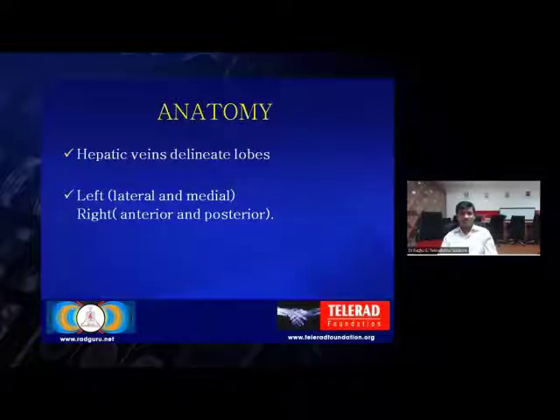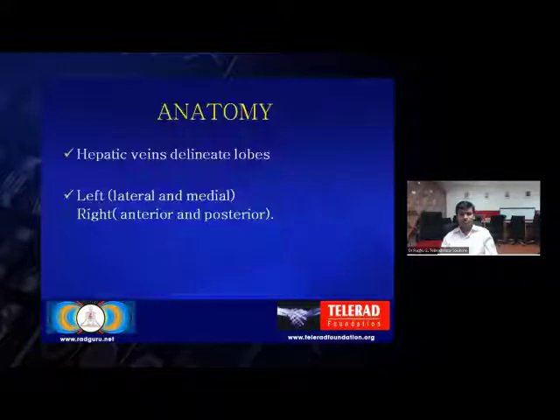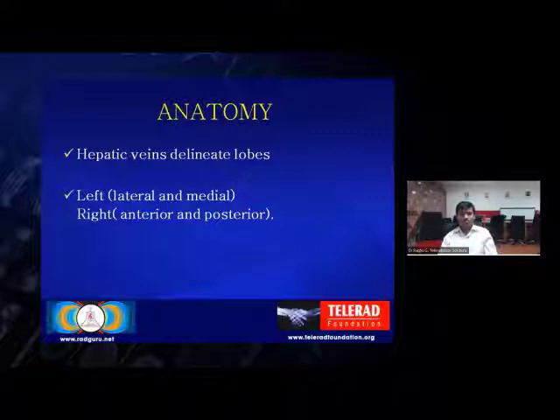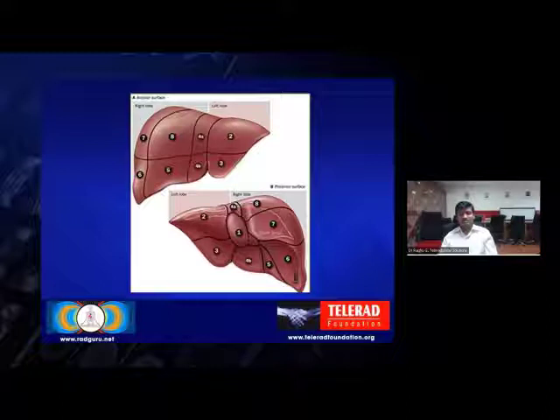The hepatic veins actually delineate the lobes and the segments. The middle hepatic vein divides it into right and left lobes. The left hepatic vein divides it into the medial and lateral part of the left lobe, and the right hepatic vein divides it into the anterior and posterior segments of the right lobe.